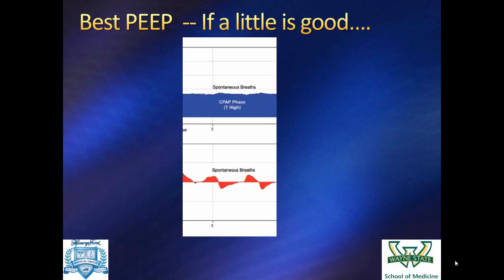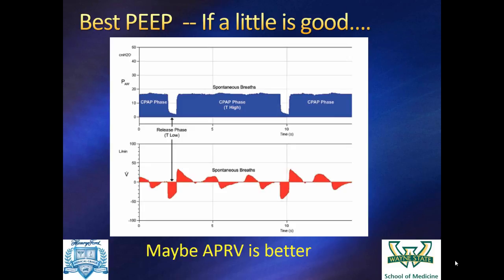And then the idea, if you take this to its logical conclusion, if you like PEEP and you think PEEP's a good idea and you want to use a lot of it, if a little's good, then more is better, and we get to APRV. In theory, and totally in theory, we're keeping the pressure the same the whole time while allowing these releases, which allow these flows, but you're having these tidal volumes in between and then having these breaths when you're having a release.